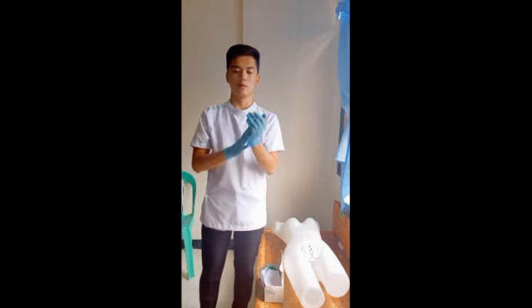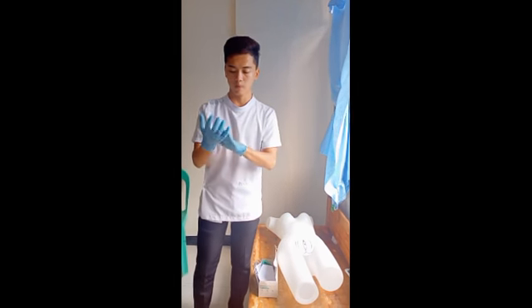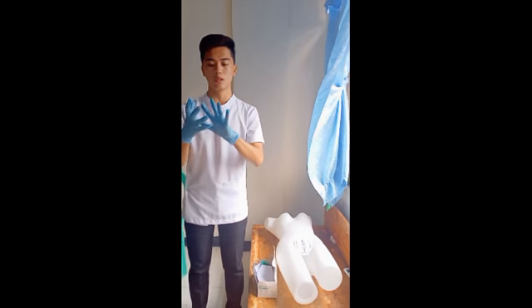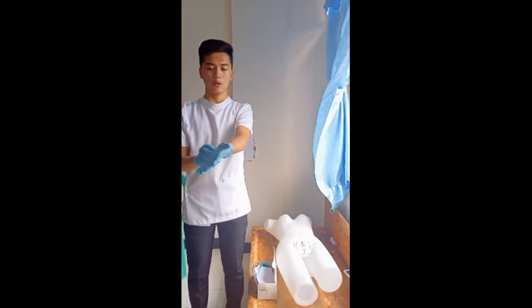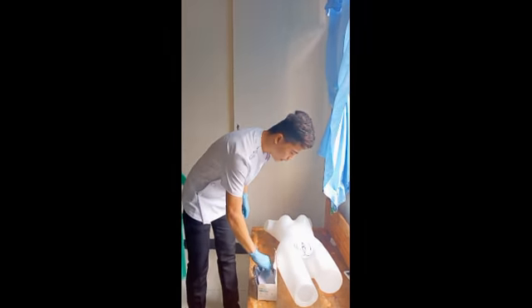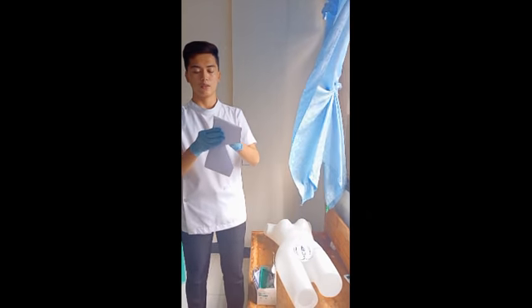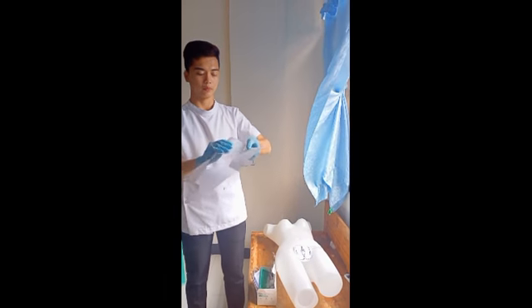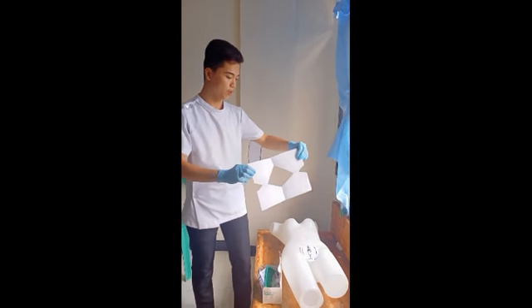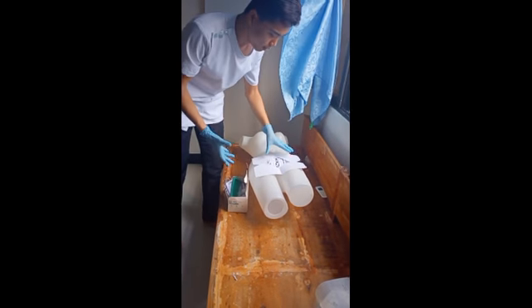So this is the glove, a sterile glove. Let's assume this is the sterile gloves, because sterile gloves prevent cross contamination and also make for a good and safe procedure. And this one is the urinary drapes. You need to position this to protect the urethra of the patient.